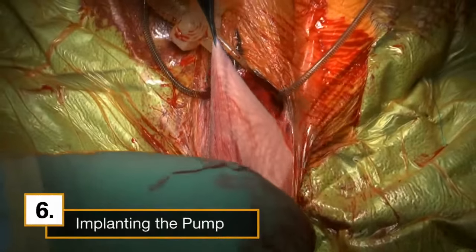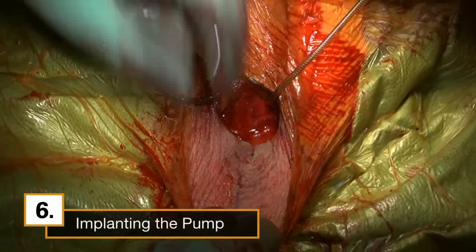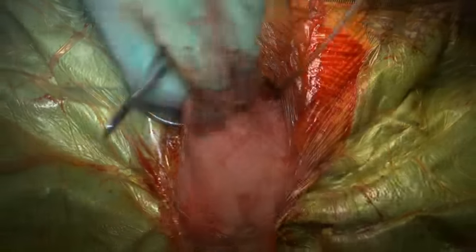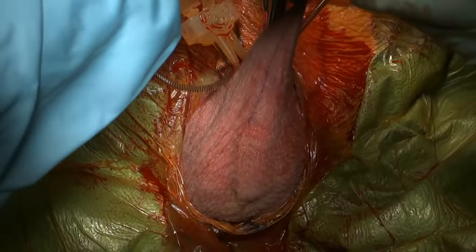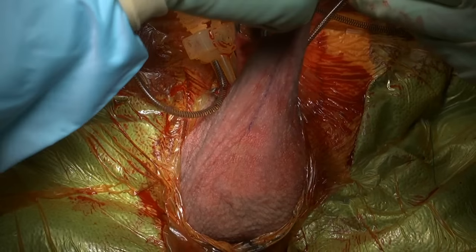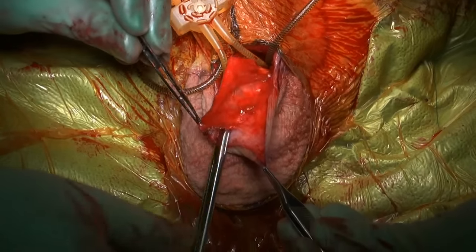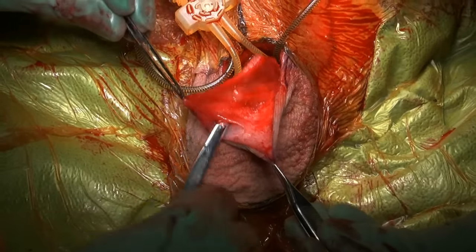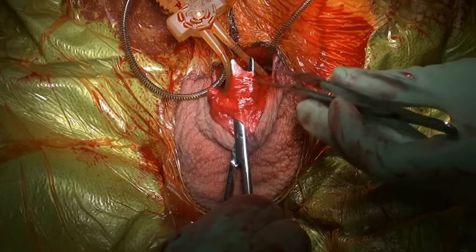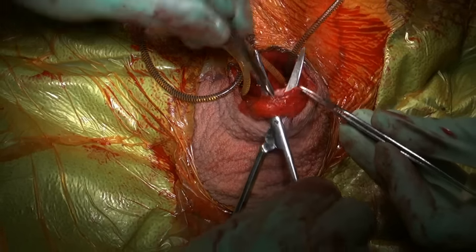Now it's time to position the pump. We are going to expose more skin for the first time. We exposed the scrotum so I can have the most accurate placement. I create a vertical wall with the scrotal skin and I use a Metzenbaum scissors to form a pocket in the most dependent portion of the anterior, midline scrotum. I then rotate my scissors cephalad to pass through the septum to create a nice mass of dartos tissue to cover the tubing and keep the implant components away from the skin surface.